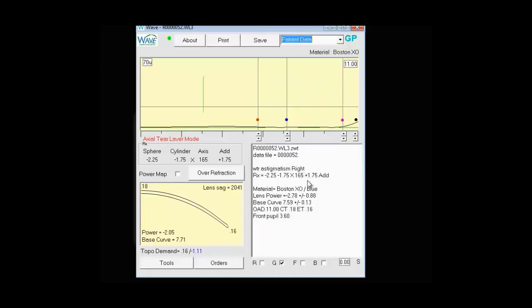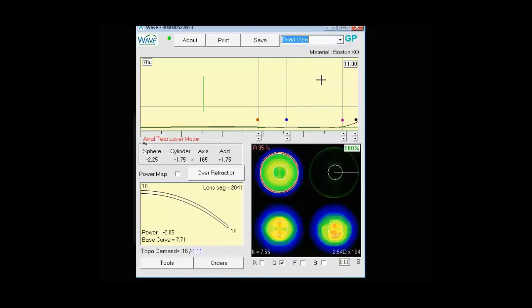Patient data is a good reference. It tells you the file name, the Rx that's in there. If you had any over-refractions in there, it would tell you that as well. And it gives you some basic information about the contact lens as well. For most design purposes, you'll be using quad view.